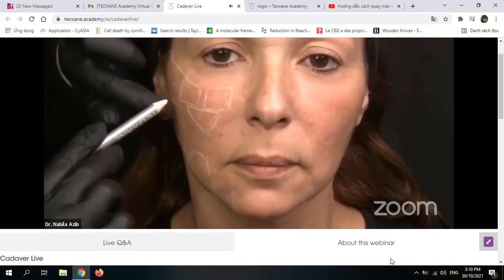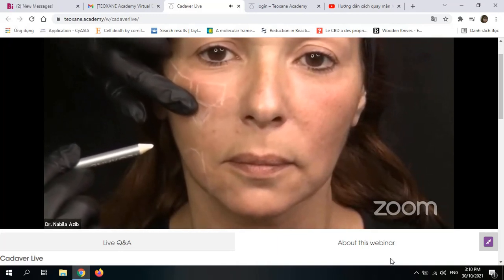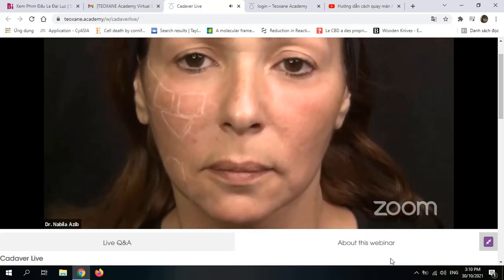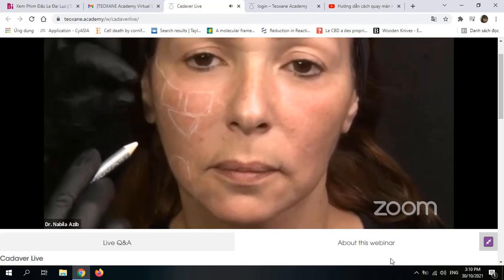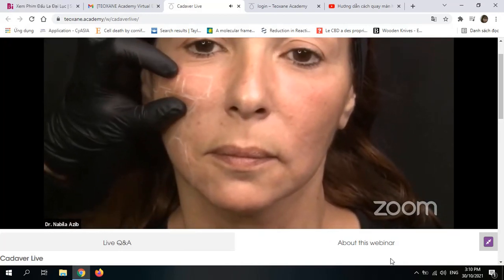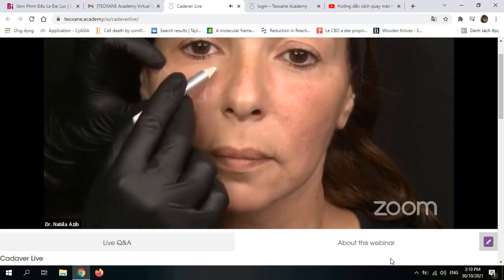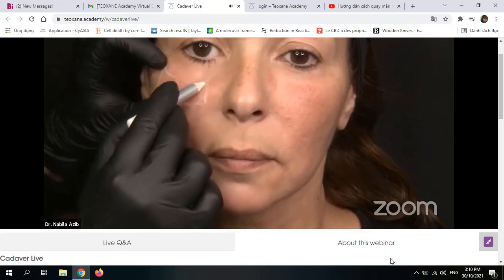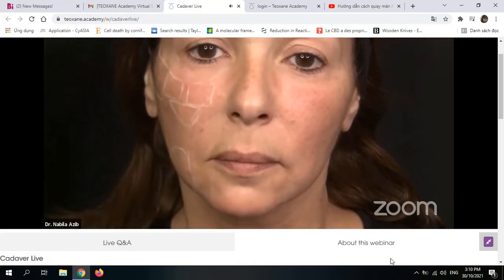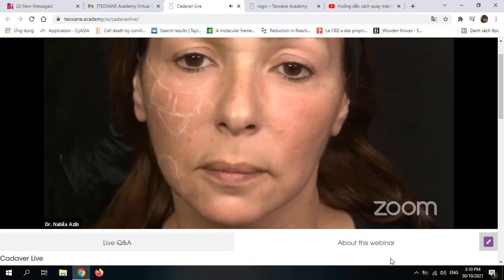And then I will work also with the multi-layering technique to lift and tighten the skin here with superficial injection with RHA4 here. This mid-face projection will help me for two other areas. First, it will improve by lifting the orbital retaining ligament. The second area I will be treating will be the infraorbital area. And here I will work with Redensity 2 with the cannula technique.